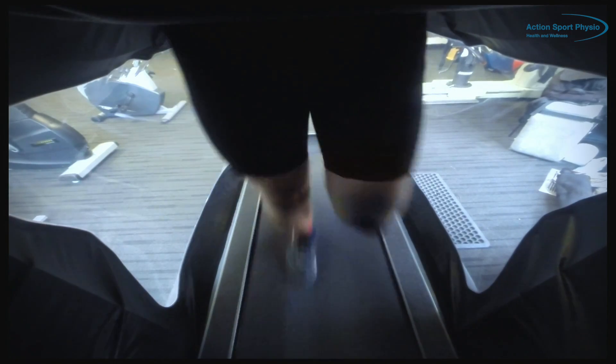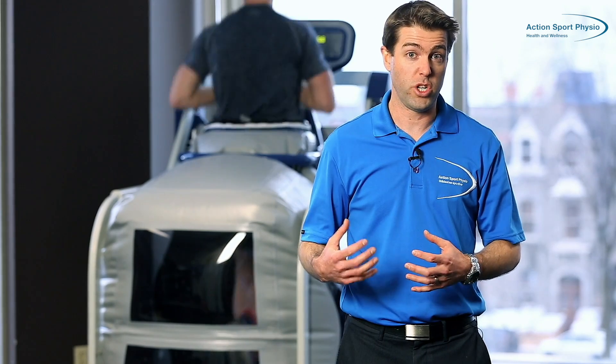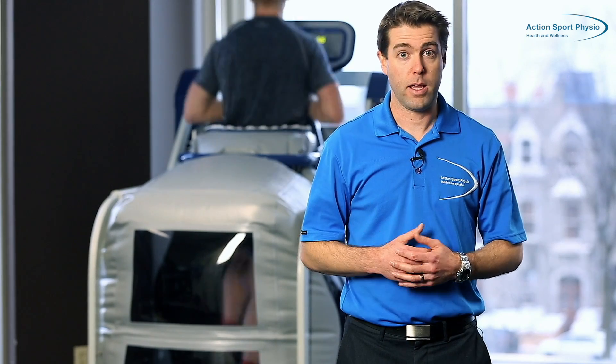For instance, someone that has a tendon issue — we could reduce their body weight on the Alter-G by 50%, get them to run for many, many minutes, even up to an hour.